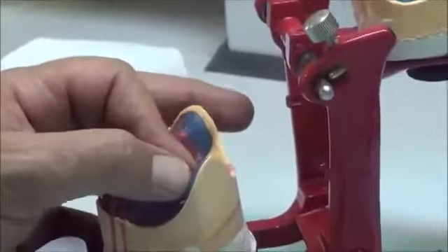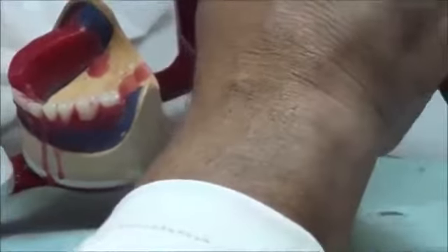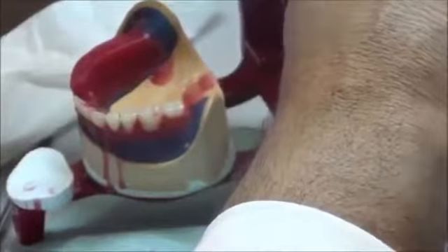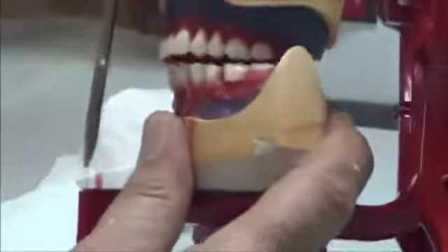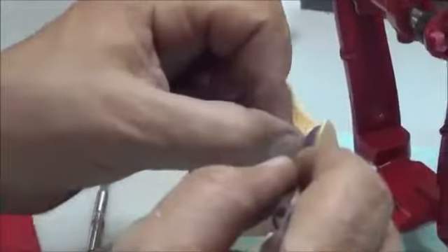So if the tooth is touching the base plate, let's follow the rules that we have done for teeth that don't have space, and that is trimming from the wax first, and then trimming from the base plate, and then trimming from the tooth itself. Okay. Before closing, we just made sure that no extra wax is present on the upper, and now the tooth goes into contact with the upper 7, and once we finalize it, we go lingually and fit it into place.